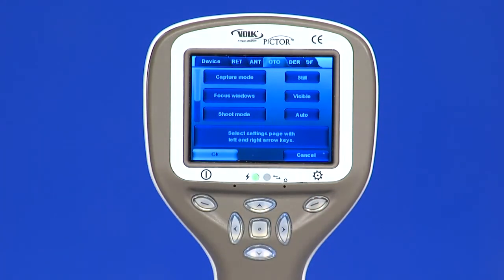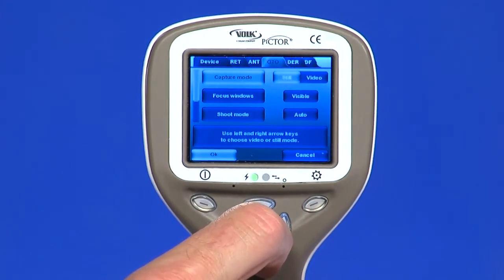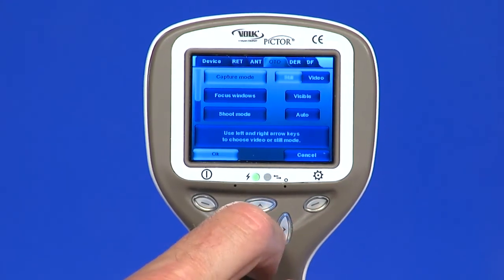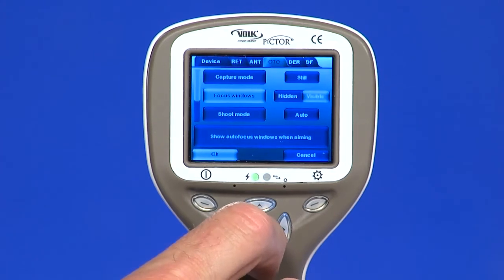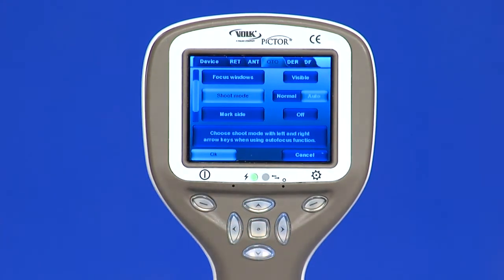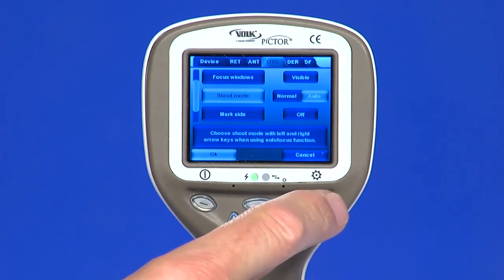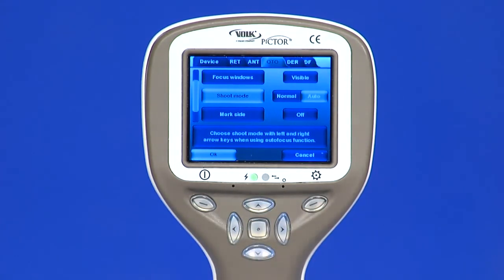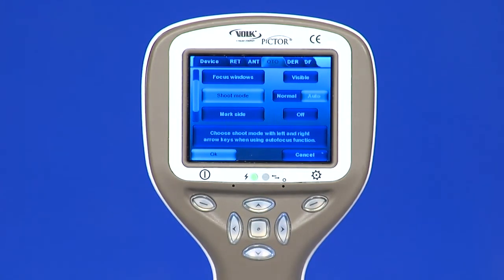The arrow keys change values in the menu. An active value is indicated with a light blue color. Changed values are saved by using the left soft key, OK, and cancelled by pressing the right soft key, Cancel. Some values are confirmed by pressing the middle key.